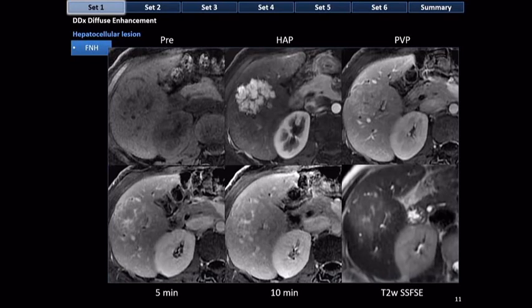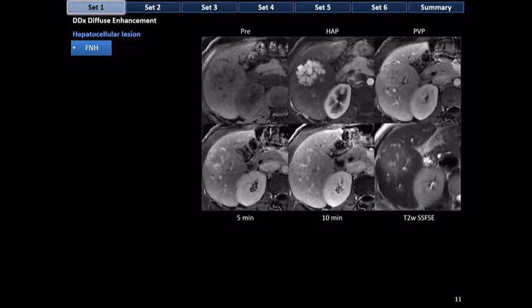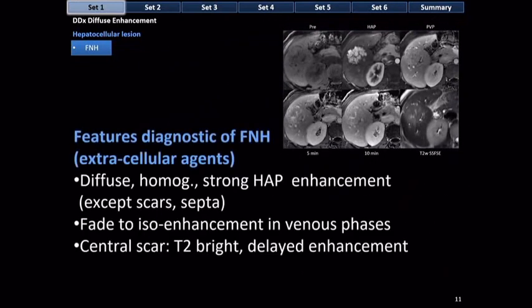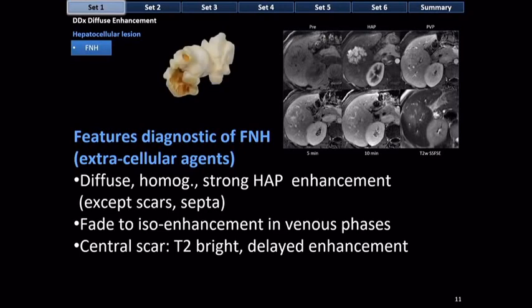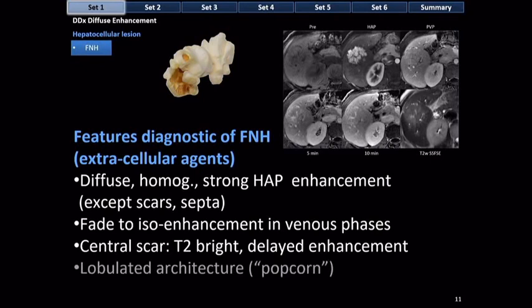In summary, one of the helpful signs for FNH is that it looks like popcorn — multiple subnodules separated by fibrous bands and scars, each enhancing to the same extent. When you see a lesion that looks like popcorn, think FNH. This is just another example of the diffuse hyperenhancement of FNH, which is homogeneous except for areas of central scar and fibrous septa.